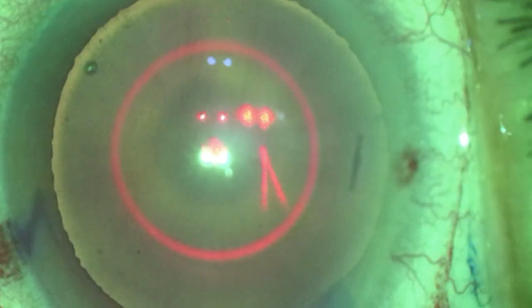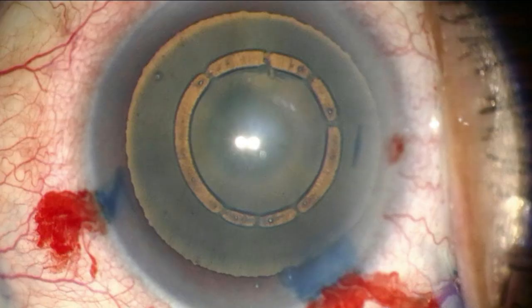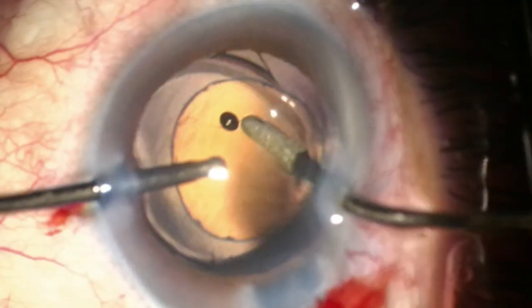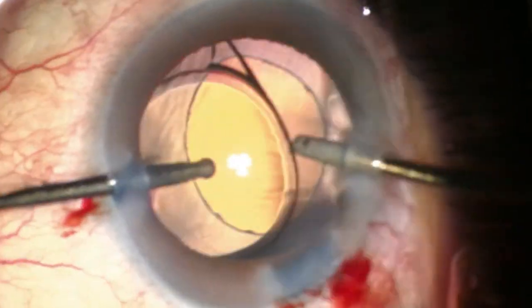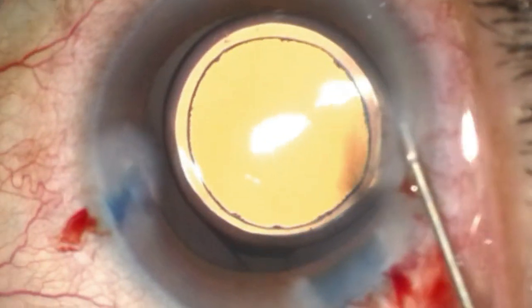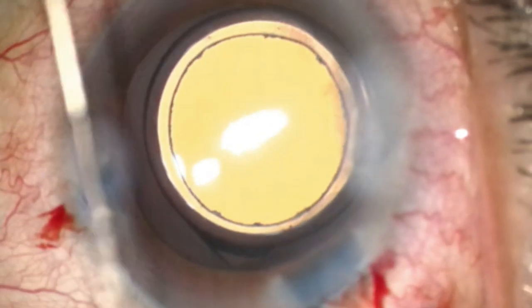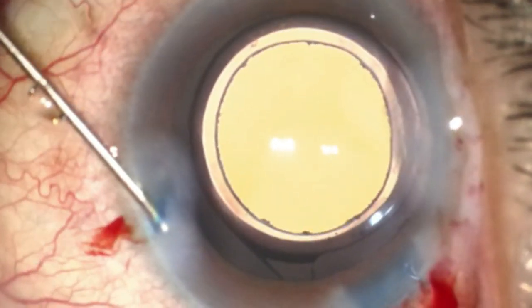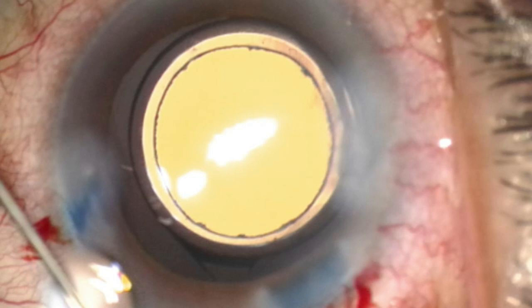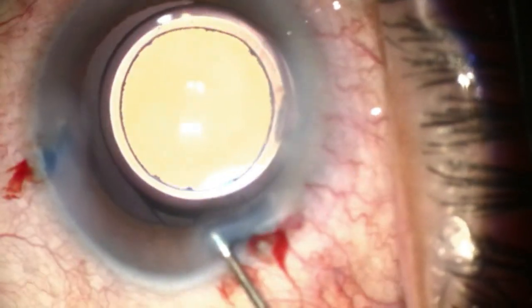Look at the concentricity of the capsule laser circle with the central tri-band landmark. The capsulorrhexis is concentric with the tri-band central landmark; however, it is eccentric with the pupil center, as is clearly visible. After implanting the IOL, look at the beautiful result of 360-degree symmetrical overlapping of the capsulorrhexis with the edge of the optic of the IOL, and look at the eccentricity of the capsulorrhexis with the pupil center.